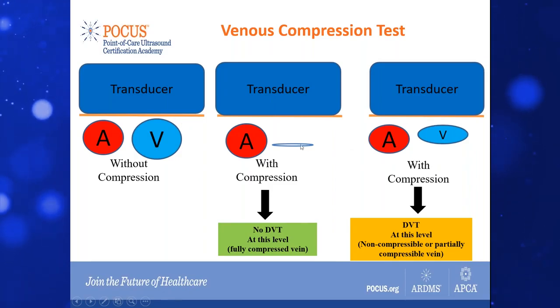Essentially, this would be a normal finding when it totally collapses — the anterior and posterior walls touching each other.